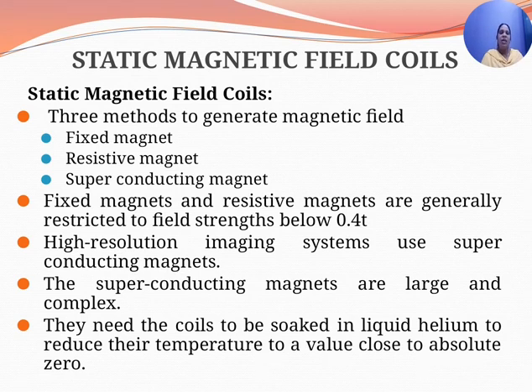For high resolution imaging systems, we use superconducting magnets. The superconducting magnets are large and complex. They need the coils to be soaked in liquid helium to reduce their temperature to a value close to absolute zero.